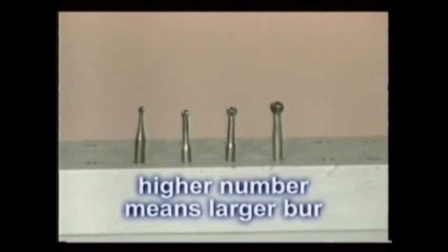Fine-bladed finishing burrs of many shapes and sizes create surfaces that are free of scratches. Costing a good deal more than disposable burrs, they require extra care in cleaning and sterilization. These burrs usually have gold shanks. As a rule, the higher the burr number within a group, the larger the cutting end. For example, the number 8 slow-speed round burr shown here is larger than a number 4, and so on.